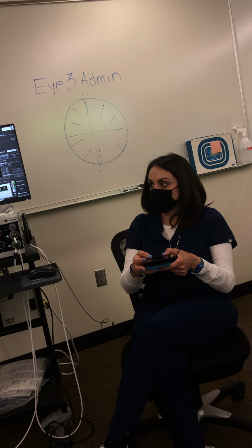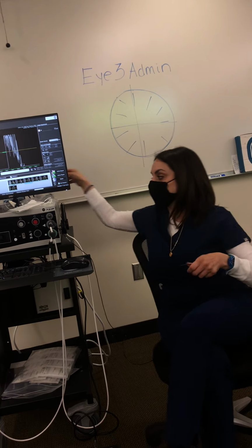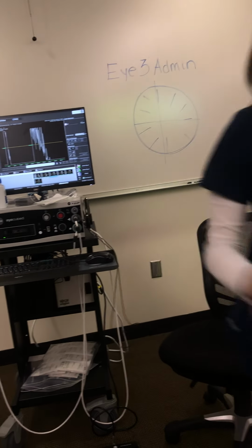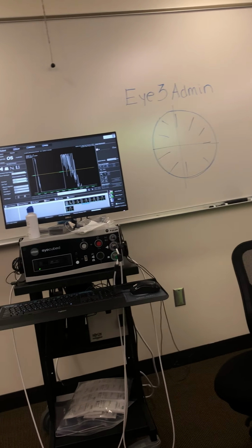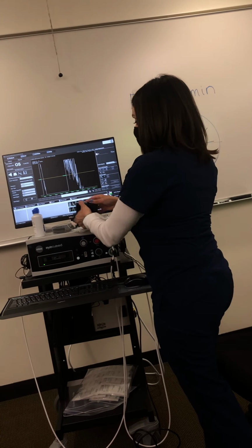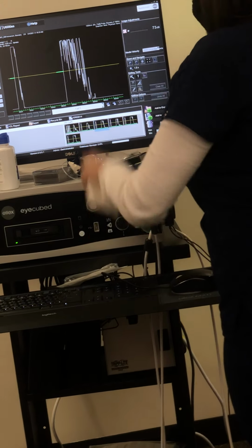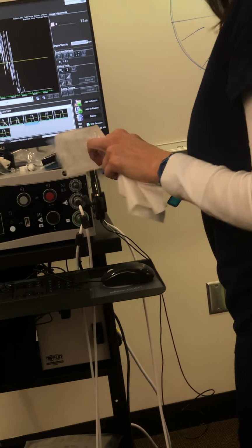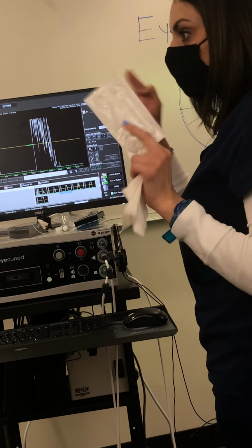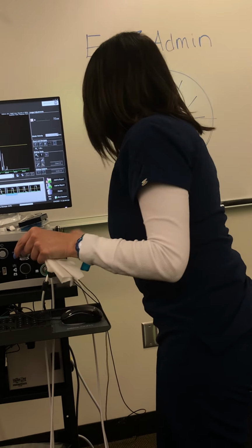Do you need a helper for that? Just an extra set of hands? When you're first starting, yes. What I usually do is take a wad of tissues and go like this. This is how I do all my A scans, I don't use that. Really? Never. It's just my personal preference. I don't have time to fumble with BSS tubes, bottles and whatever else. I know I sound like a tyrant, but.